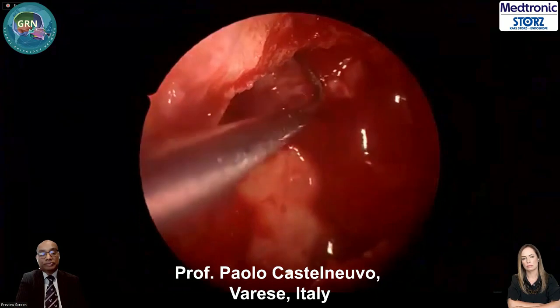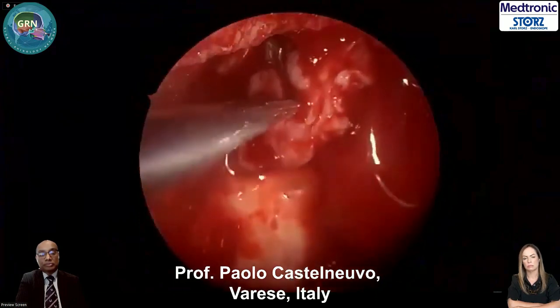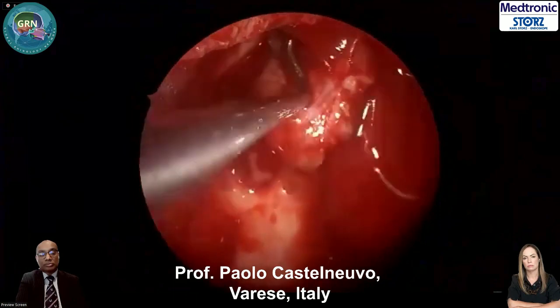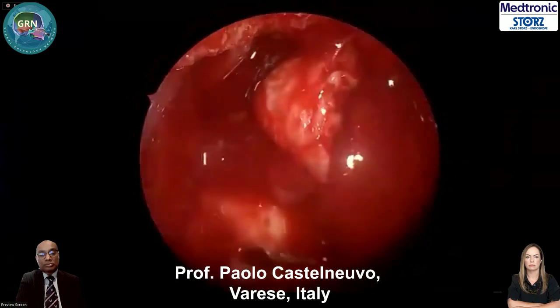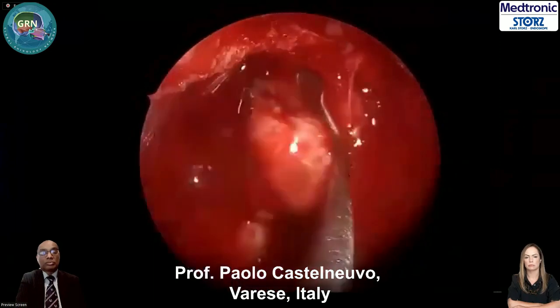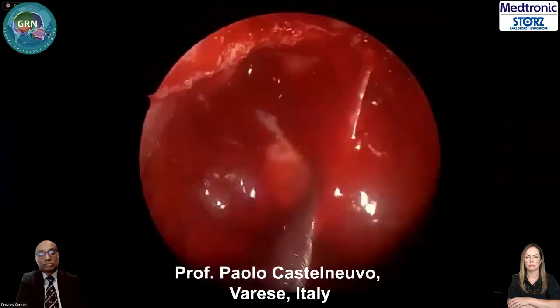And now with the curved instrument, we make a subperiosteal dissection of the anterior and of the roof.